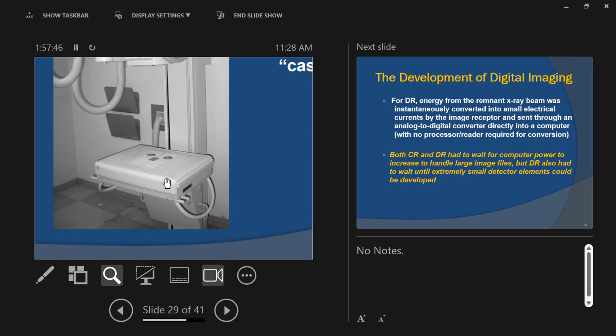So expensive. Yeah. $3,000, $4,000, $5,000, $10,000. Oh yeah, easily. And different places have different stuff. Some of you will have a chance to intern with Cottage Urgent Care, and they have actually pretty cool X-ray equipment there. I think it's all based on veterinary medicine, so it's really, really mobile because animals have to move around everywhere. So their whole unit is all built in together. The X-ray tube and the detector are all one big thing that can rotate around the patient, and there are no cassettes in tables. There's no Bucky tray in the table. The table's a table, basically. It's nothing special anymore.